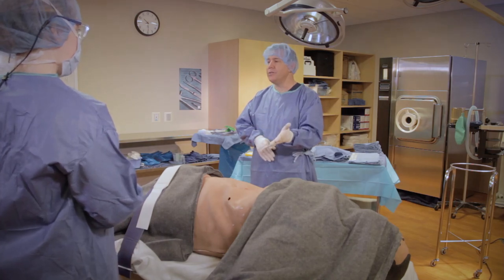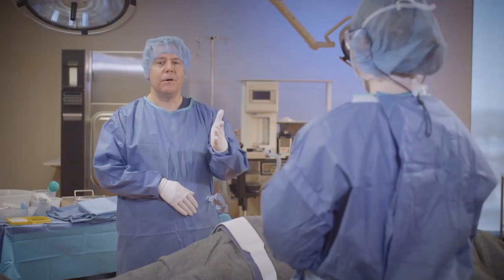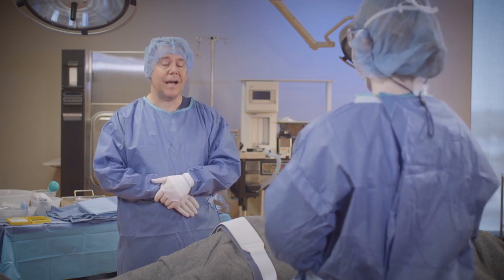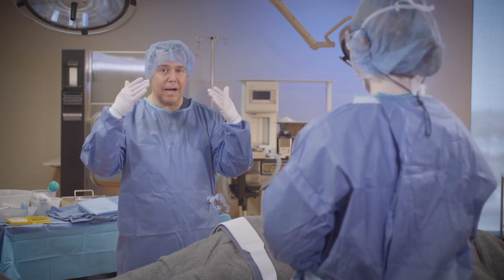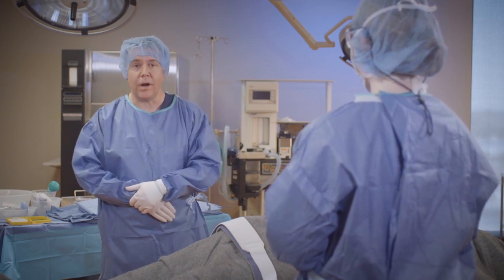So first let's start with supine position. I have my good friend Charlie the mannequin acting as our patient and my good friend Emma who is going to act as the surgeon. For demonstration purposes, I am not wearing a mask or my goggles. First thing are the medium sheets or half sheets.